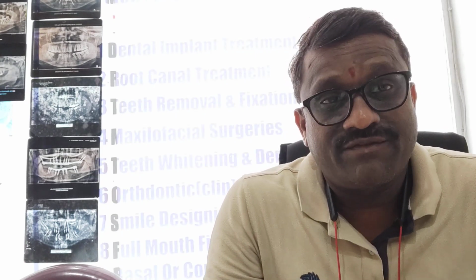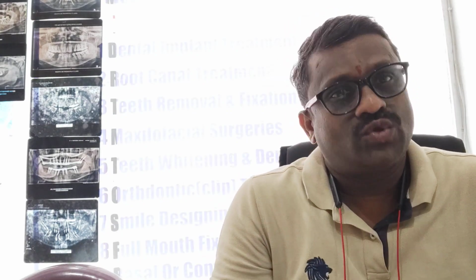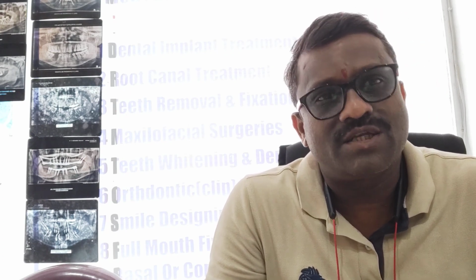So that is the difference: in conventional implantology, it is through osseointegration, whereas in basal implantology, the method is through osteo modulation or osteo fixation.